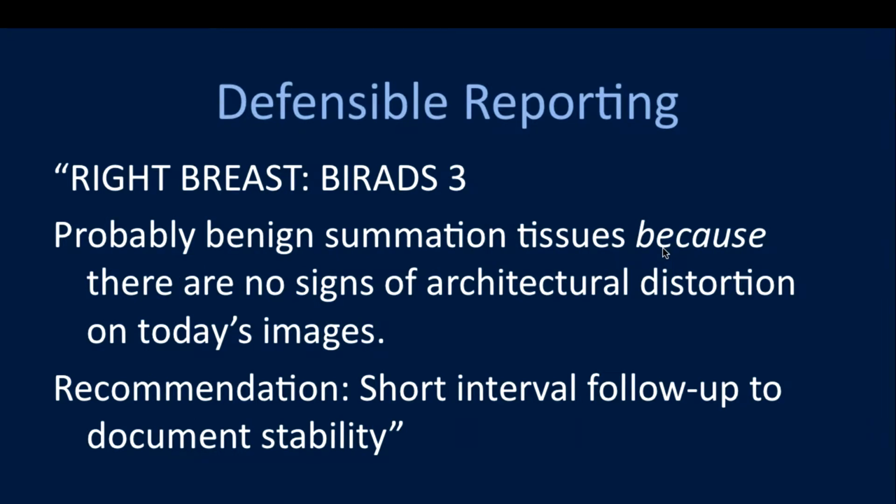So one suggestion that I'll commonly say to the residents is that whatever category you're using, whether it's BI-RADS 3, start your sentence with that and be able to explain in your head why you think it's a 3, or if it's benign calcs, why are they benign? Benign calcifications. Why? Well, maybe they're teacup, maybe they've been stable for 2 years, maybe paucity of number. Why do you think it is?